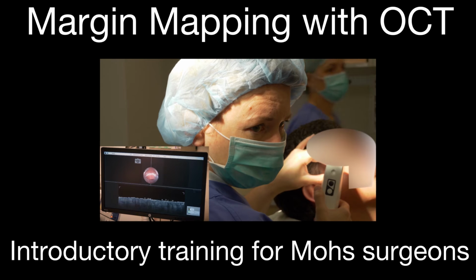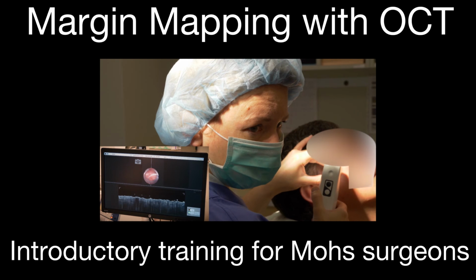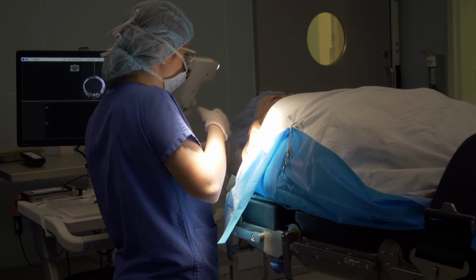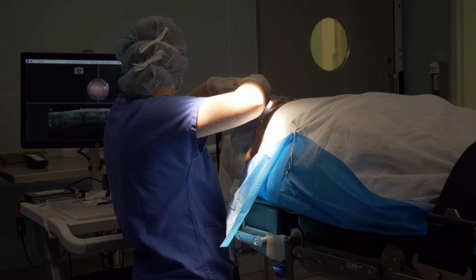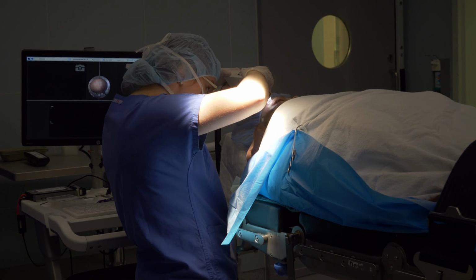This training video, designed especially for Mohs surgeons, is going to teach you what you need to know to successfully use OCT to guide Mohs surgery. OCT allows you to see the extent of the tumour beneath the surface of the skin and therefore map the surgical margins prior to surgery.